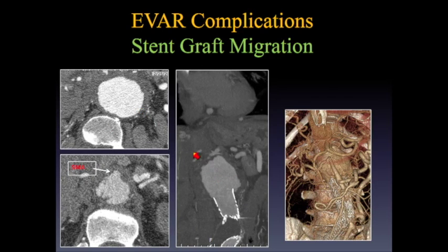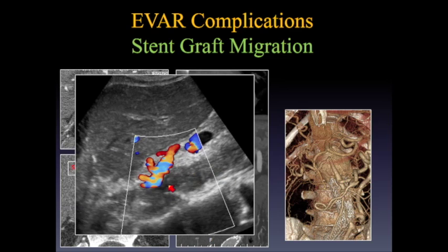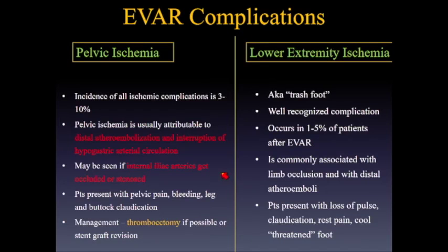So what we see here on the CT is a mid-abdominal aortic aneurysm that is pretty big and involves the SMA, and we see that the stent on the coronal images has migrated downward, and it's really not covering the aneurysm. And the same thing you could see on the reconstructions. On ultrasound, again, we see that there is flow within the SMA and some flow, we didn't detect it here, but the stent is not visualized in the expected location where the aneurysm is.